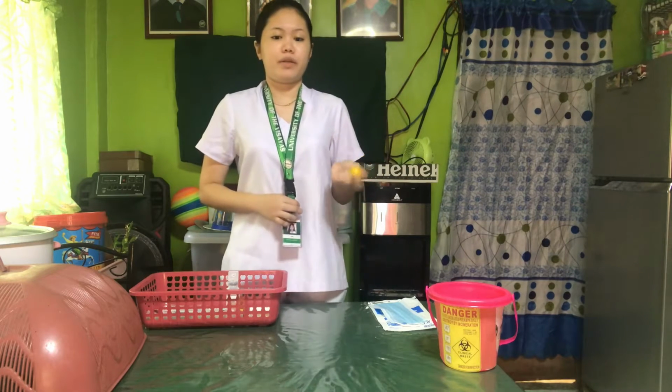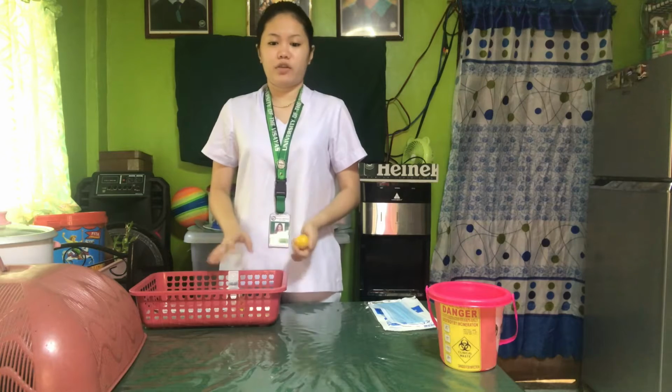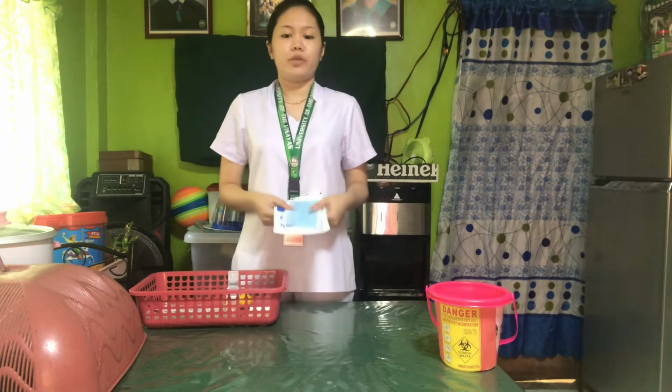and a tomato, because I cannot administer parenteral medication in this return demonstration without the supervision of a licensed nurse. I will be using this tomato, assuming that this is my patient for today, and we will be placing the equipment in a medication tray to make it convenient for us to carry the medication. And also, we have here sterile gloves and a face mask to protect ourselves and the patient from possible transmission of microorganisms.